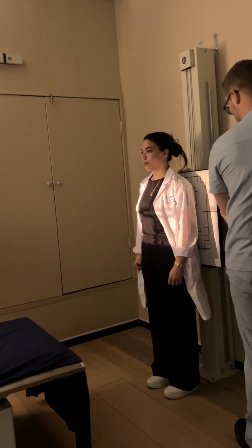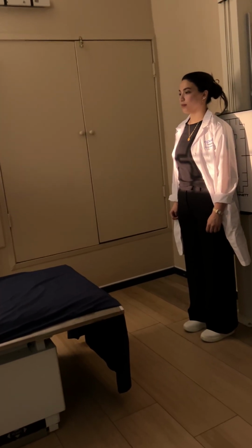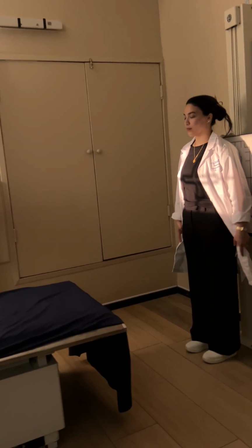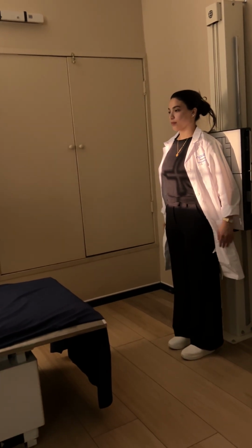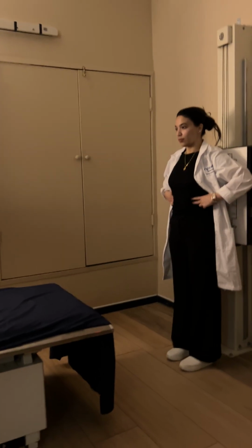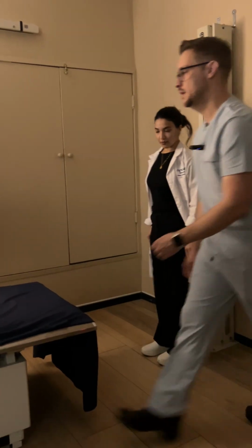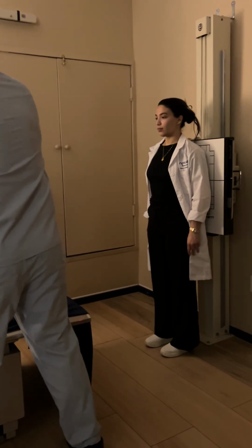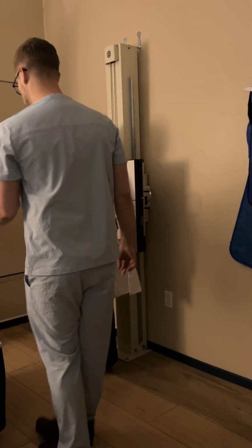On patient Noor's body habitus, we're going to go 14x17 lengthwise or portrait. What is our centering point for an upright abdomen? Absolutely right. 2 inches above the iliac crest. SID is what? 40, which makes this part very easy.